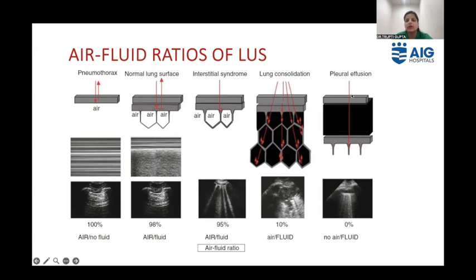In this fifth pathology, that is pleural effusion, because of the presence of the fluid, we can see a totally anechoic picture here.